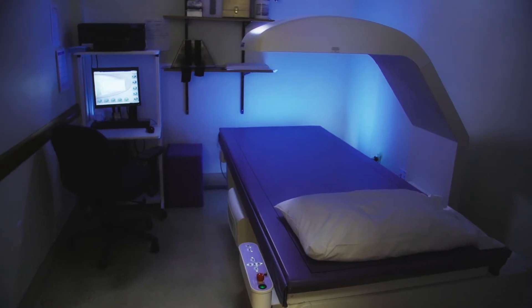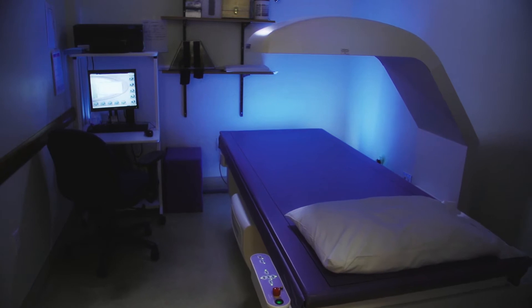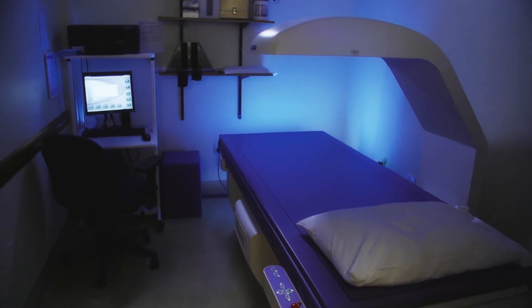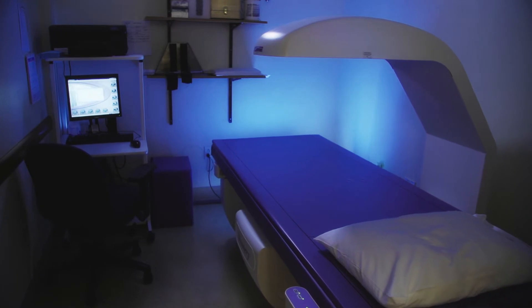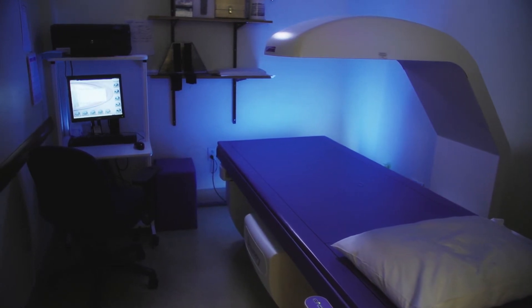Dual Energy X-ray Absorptiometry is also known as a DEXA scan. DEXA imaging technology uses a very low amount of X-ray energy to detect the presence of osteoporosis.